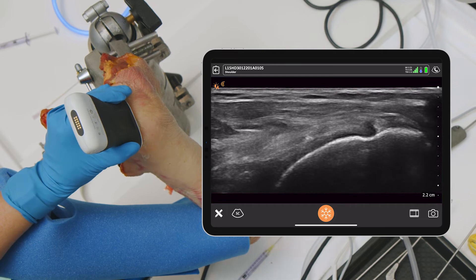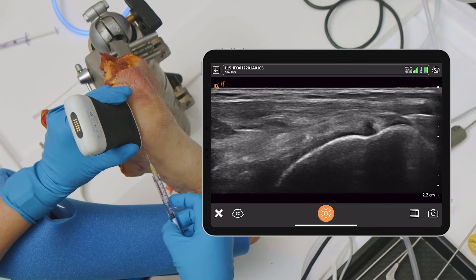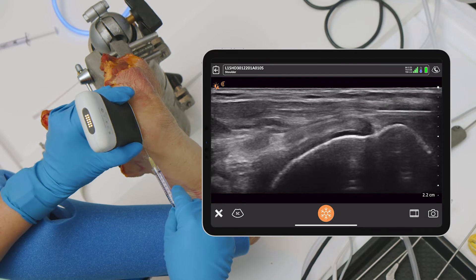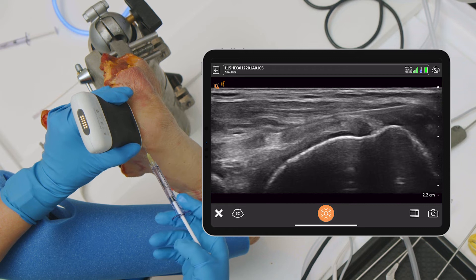So there are different things we can do. If you're going to do an injection for the subacromial space, this would be the ideal spot, right here. Coming into the area, you can see going right under that double white line right there. We can optimize our image — and there we're in the subacromial space right now.